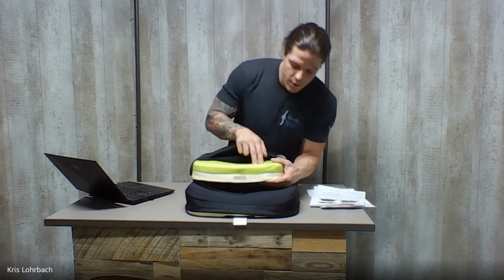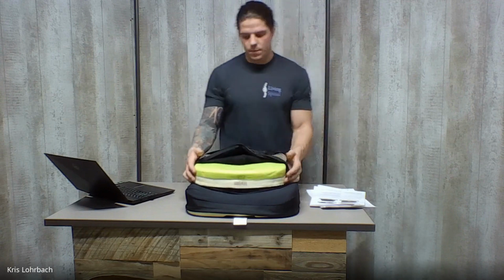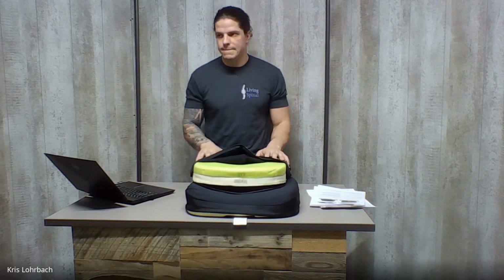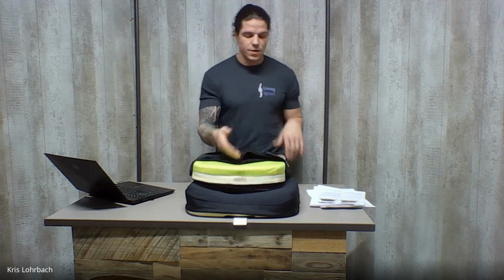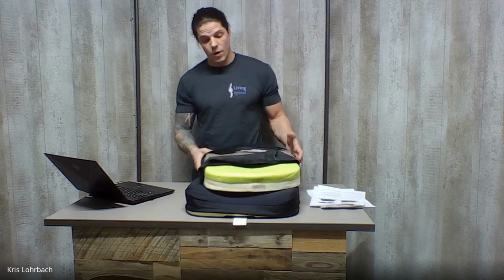So this top layer you can see is really nice and soft. This bottom layer is a lot firmer. They do that because then they can contour them and give you a firm supportive base, and the top layer is going to give you a little bit more pressure relief and comfort. So it's a lot easier to get an inexpensive foam cushion that does what you need it to do, and they work well and they're comfortable.